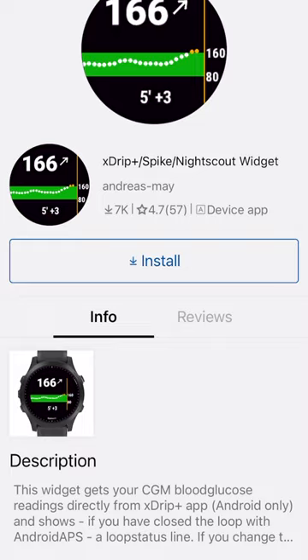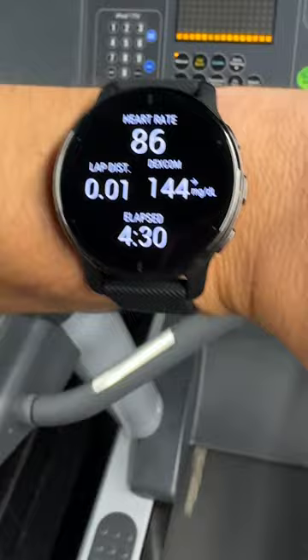You can add a complication to workout watch faces to see glucose levels alongside other stats during a workout. My Apple Watch can't even do that.